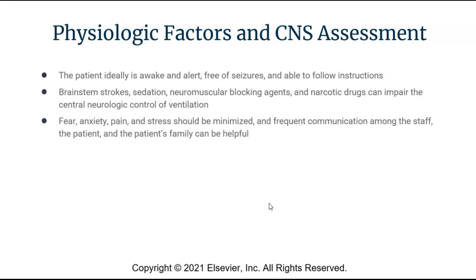Another thing I just have to say is, don't switch somebody to pressure support and leave the unit. Minimize that as much as possible. Obviously you can't be in the room for 30 minutes, but I like to be around in the vicinity of my patients that are on pressure support trials, so I can peek in, double check on them, make sure that they're comfortable still, and that we're catching them early if they're failing that weaning trial, rather than waiting until they crash and burn and their vitals change before we switch them back.